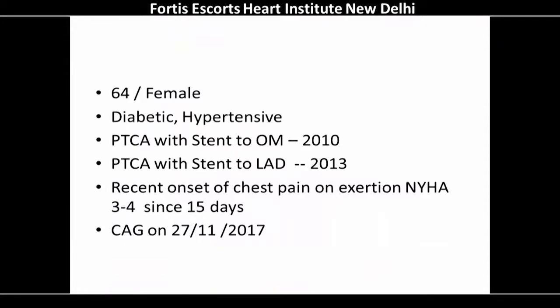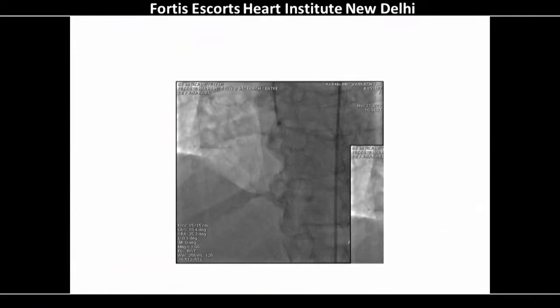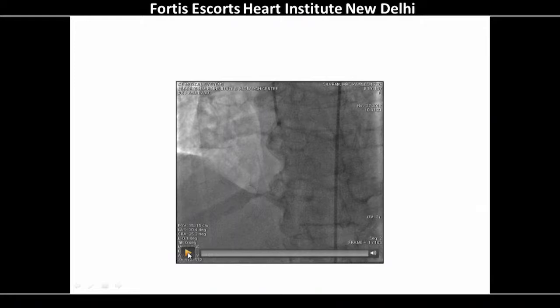Her first angiography was done on 27th of November this year only. Can I see the angio, please? That's our RCA.